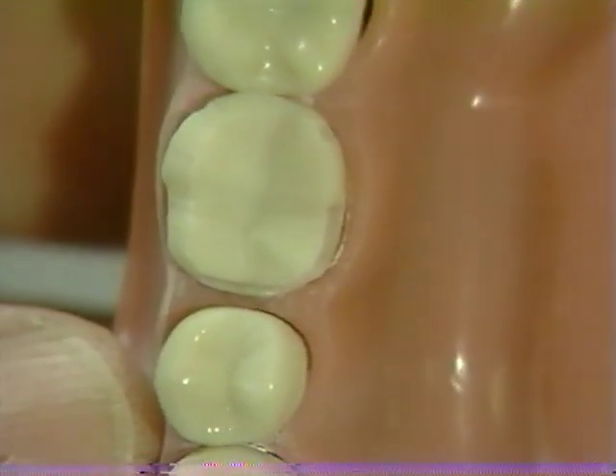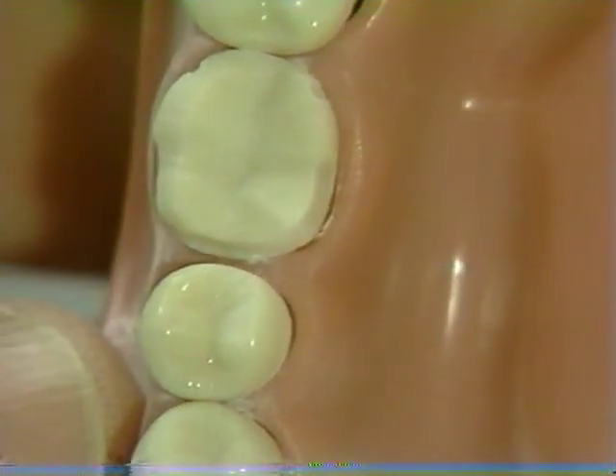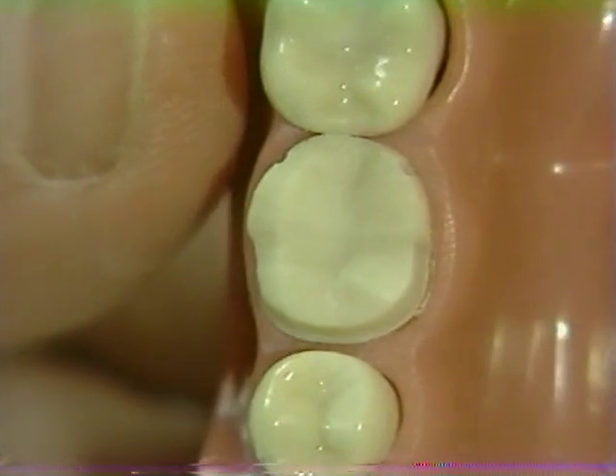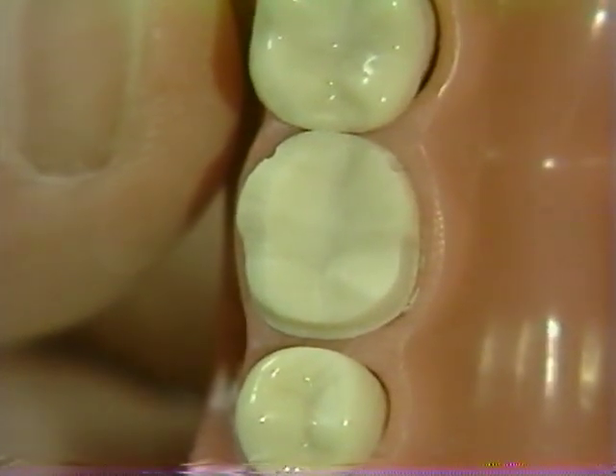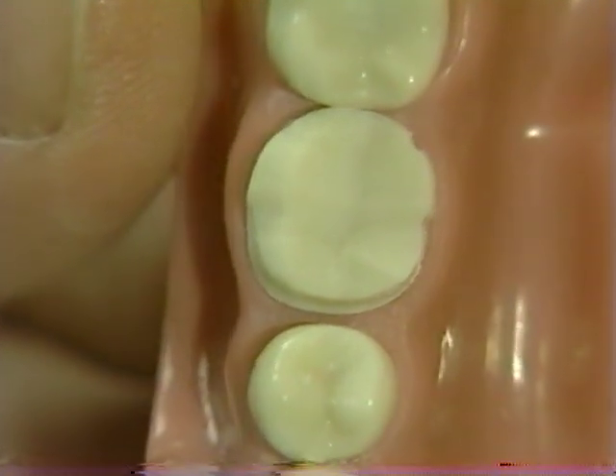Similarly, the lingual chamfer appears possibly somewhat on the light side. Additional tooth reduction is required. After the adjustment has been made, note the even width of the completed chamfer.